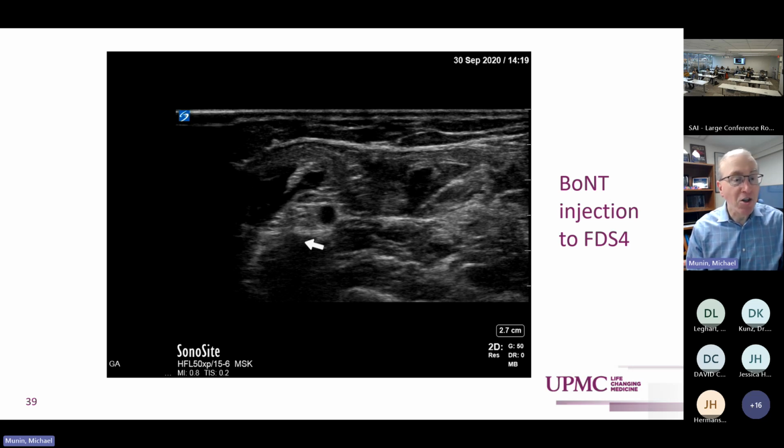So just a good little slide to show you how relevant ultrasound guidance is to making targeted, accurate chemodenervation injections. And hopefully you're perhaps doing some of that at your local facilities. If not, there are great ways to learn at our national meetings. We're usually trying to teach and show some of these techniques for those interested in wanting to learn.